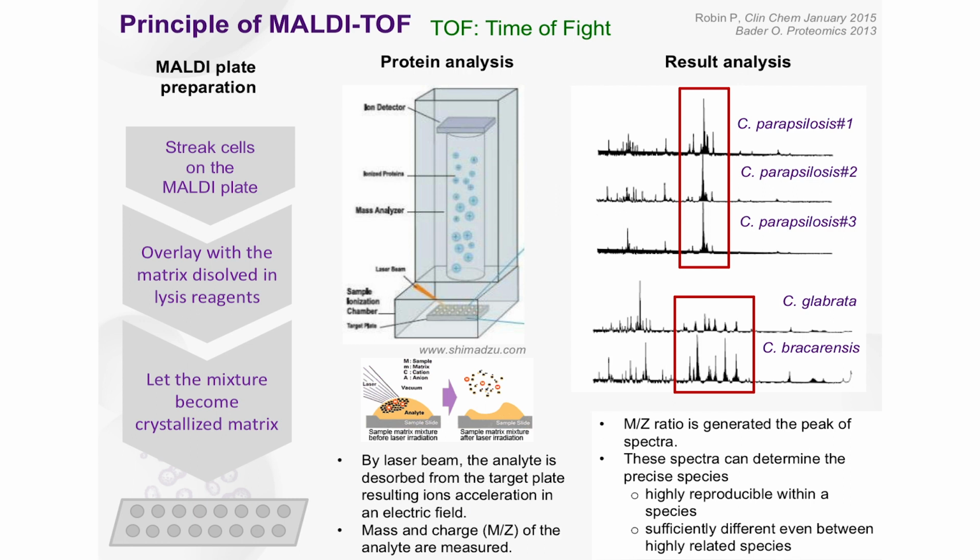So here are the steps. What are they doing here? This machine costs more than one luxurious house. You could get a Mercedes-Benz instead of this machine. But after you get this machine, you can help so many people. You can prepare one culture plate, and you can put at least 24 or 96 or however many cultures that you want to do.